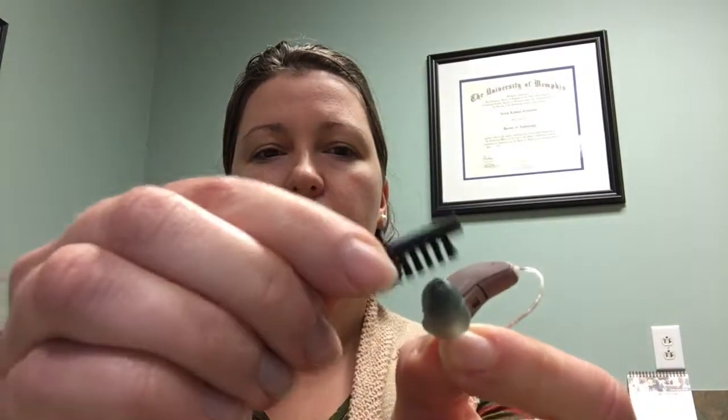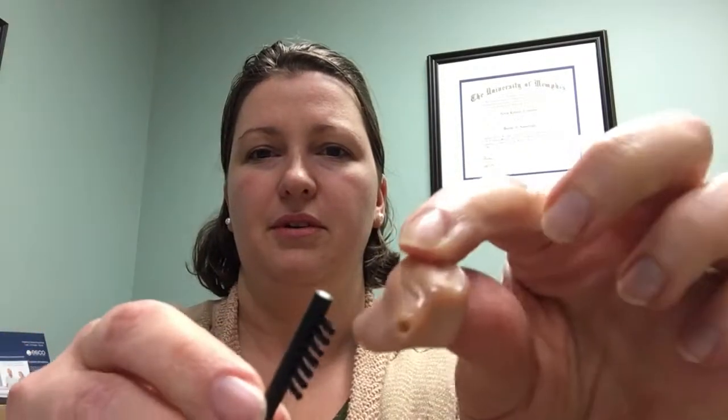The third thing to check, and often the most frequent culprit, is that the sound is having trouble getting out of the hearing aid into the ear canal. Earwax and the moisture of our bodies just invite that getting clogged up a little bit more easily. So, checking the tip of the device with your brush is a good first step, whether it's this type or this type. If that doesn't do the trick, most of our hearing aids have some variety of wax guard or filter to catch earwax and keep it off of the electronics.